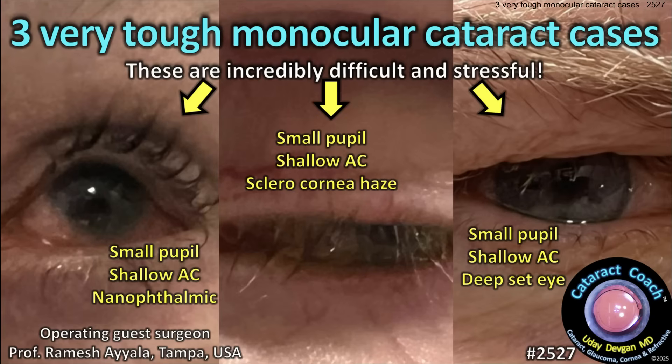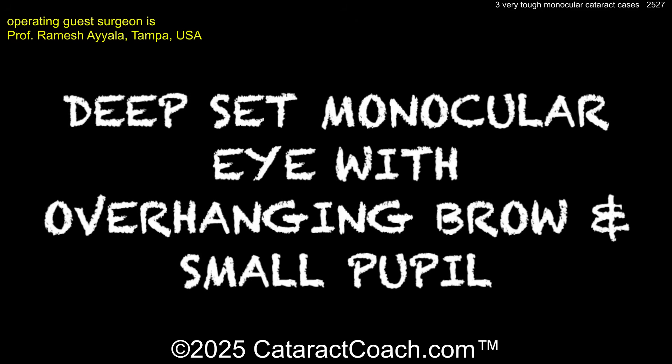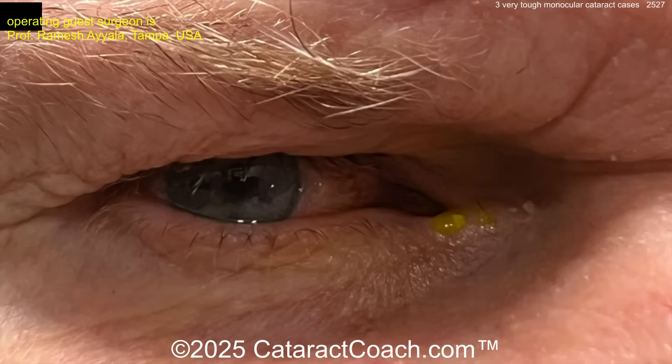CataractCoach.com — three very tough monocular cataract cases. These are incredibly difficult and super stressful. Here's our first case: a deep-set monocular eye with an overhanging brow and a small pupil.